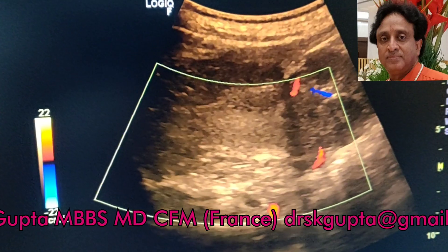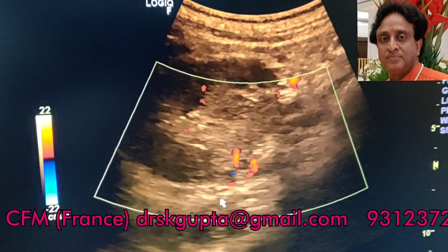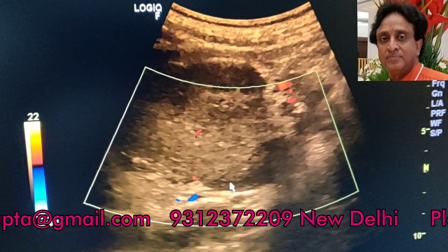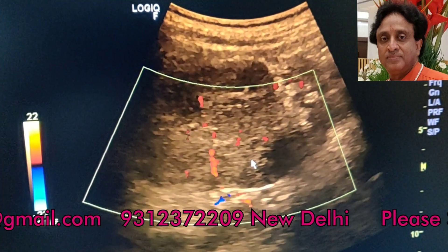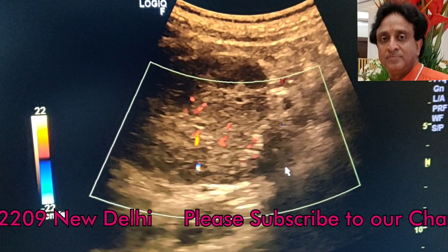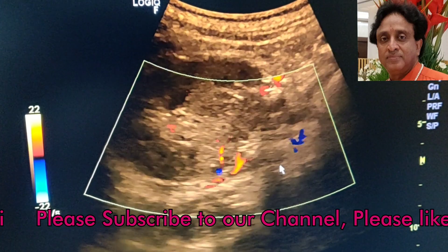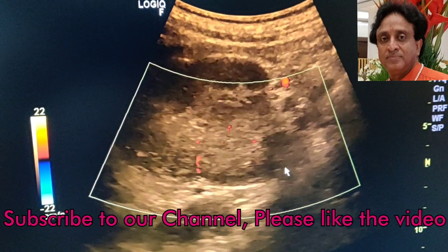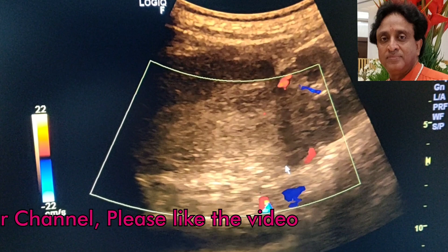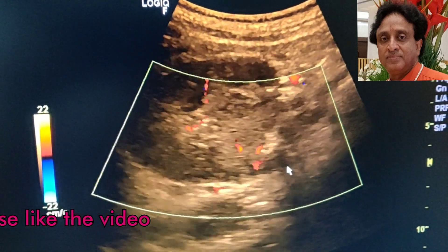This is the color Doppler examination of the supernumerary kidney and the left kidney. You can find that this kidney has a separate blood supply, and the supernumerary kidney appears to have another different blood supply. The correct examination can be done only by angiography, but ultrasound examination gives you some indication that there may be different blood supply.